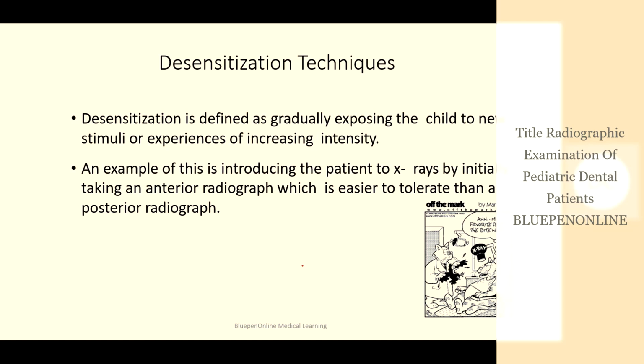One example is introducing the patient to X-rays by initially taking an anterior radiograph, which is easier to tolerate than a posterior radiograph.